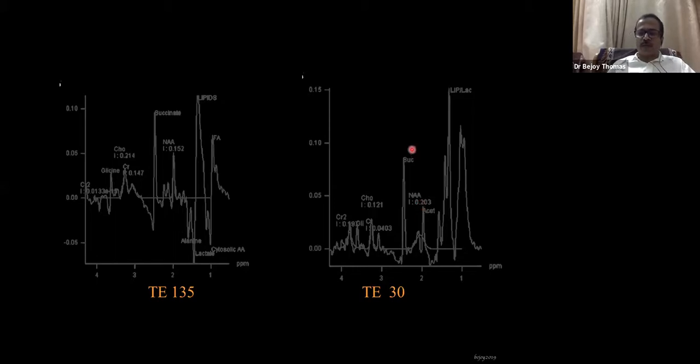So when you see all these peaks, cytosolic amino acids, alanine, plus acetate and succinate, we know that we are dealing with an anaerobic abscess, or a combination of true anaerobes and facultative anaerobes. Along with the anaerobes, the facultative anaerobes can also produce such a spectrum.